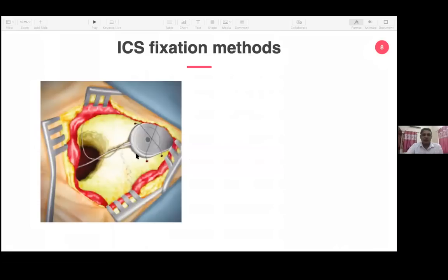Suppose you select a cochlear implant receiver stimulator whose profile, that is thickness, is very thick, somewhere say around 6 millimeters or 4 to 5 millimeters, and you have to do it in a pediatric age group whose skull thickness is somewhere around 1 to 2 millimeters, it is not going to fit.